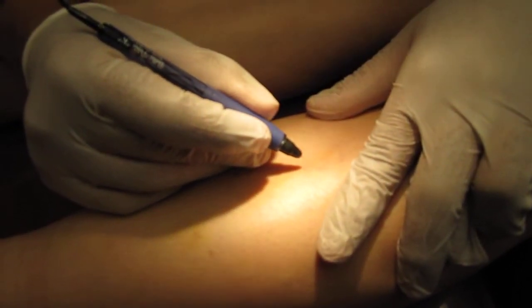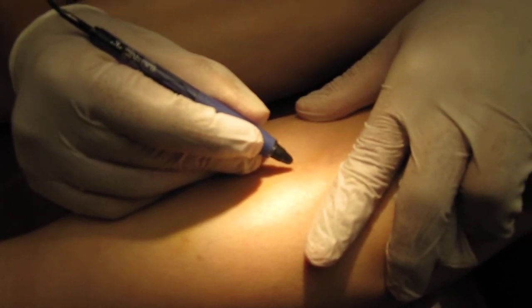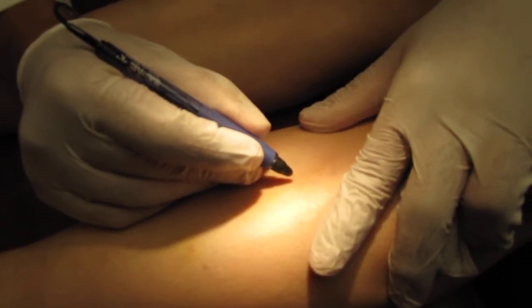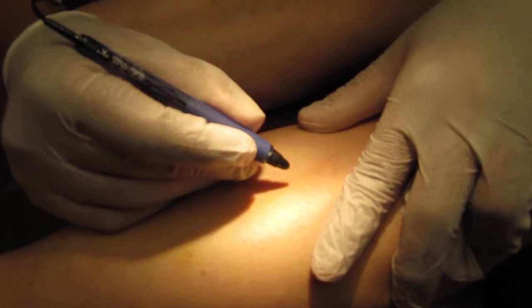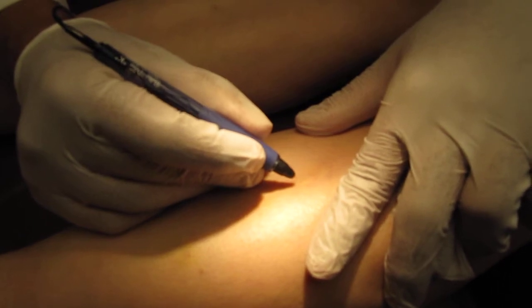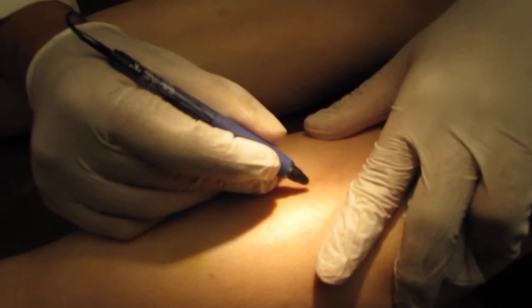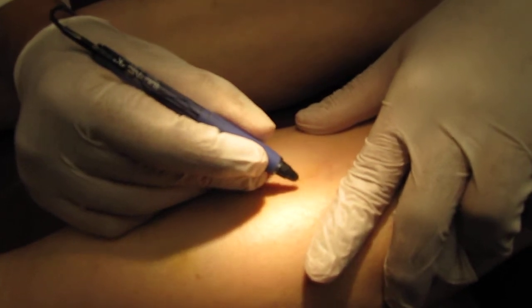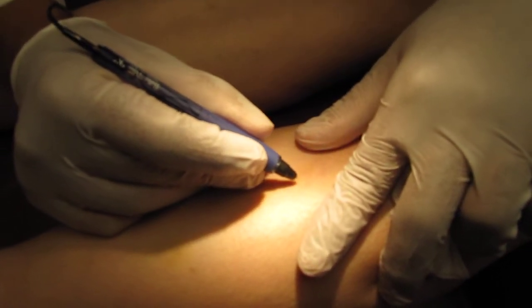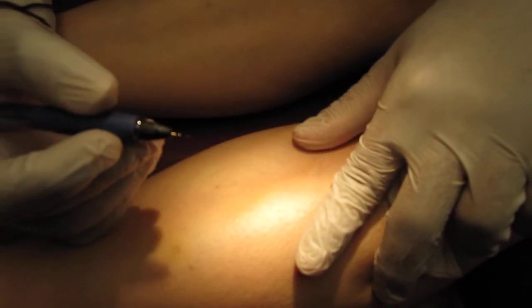You can see that she moves a little bit because it's the first treatment. We are using a special headlamp called the Cyrus headlamp that polarizes the light and makes the red vessels shine out so I can see them more accurately and treat according to the level. And the vein is already gone there.